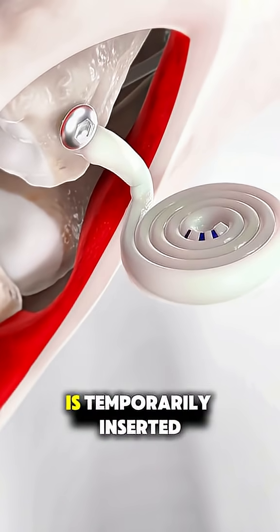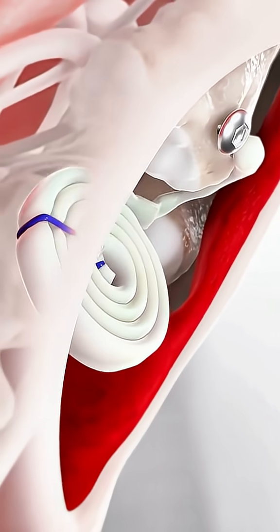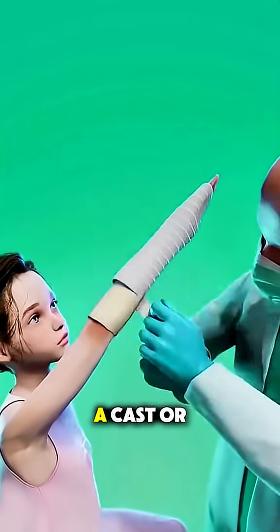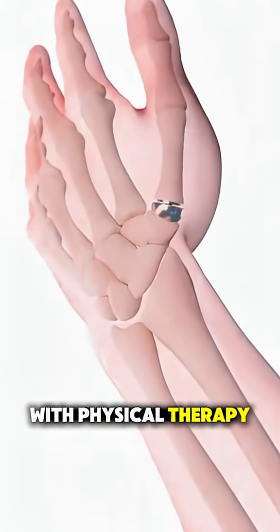Sometimes a pin is temporarily inserted to hold things in place during healing. The surgery usually takes about an hour and is often done under anesthesia. Afterward, your hand is placed in a cast or splint, and recovery can take several weeks with physical therapy.